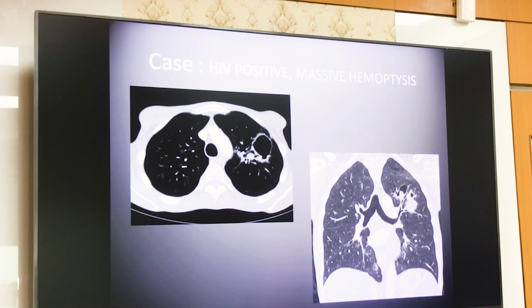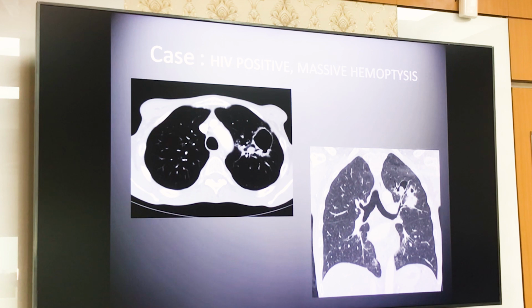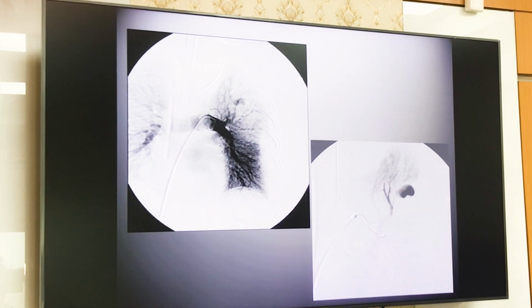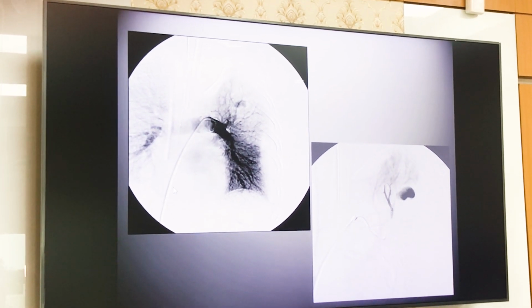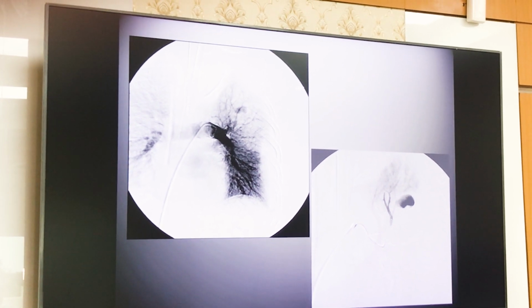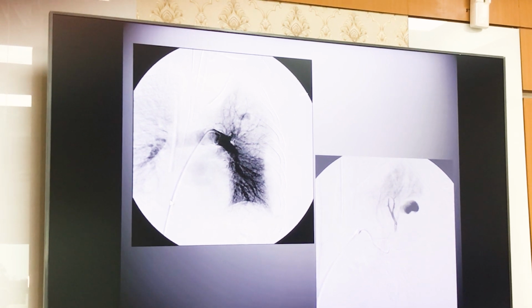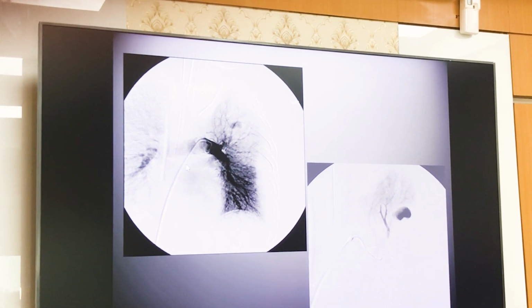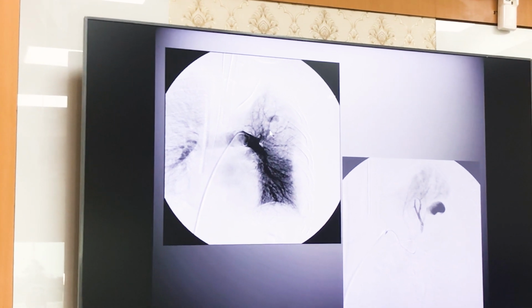Rasmussen. So this is a classical Rasmussen aneurysm. You see a nodular lesion which is bleeding into a cavitary lesion, that is Rasmussen's aneurysm. Now in these patients, we know on imaging that this is coming from the pulmonary artery. So now we will go to the venous side. We are coming from the inferior vena cava, the right atrium is here, the pulmonary artery is somewhere here, main pulmonary artery, we are going into the left pulmonary artery, and there we see this aneurysm.